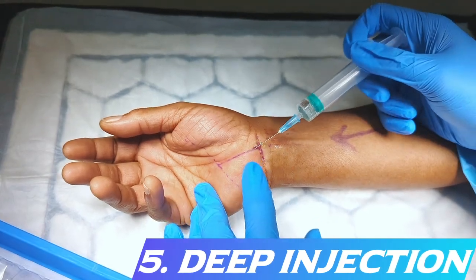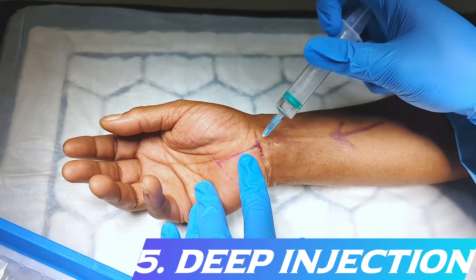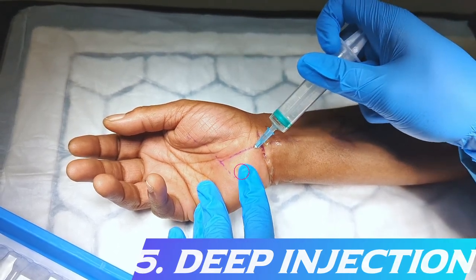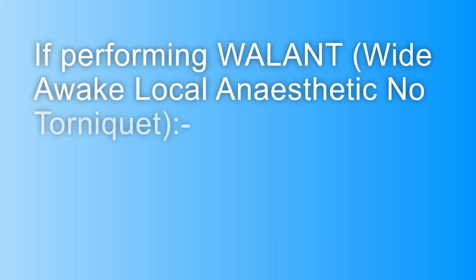With the last two millilitres of local anaesthetic, the needle is directed towards the periosteum of the hook of the hamate, as this can be sensitive when using self-retainers, especially if operating alone.